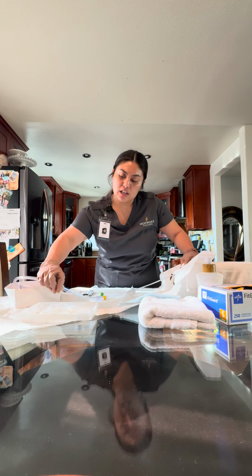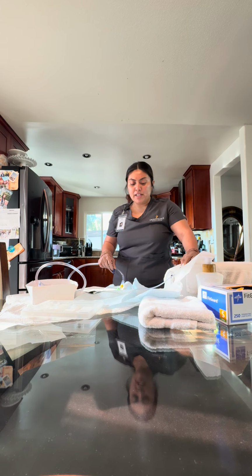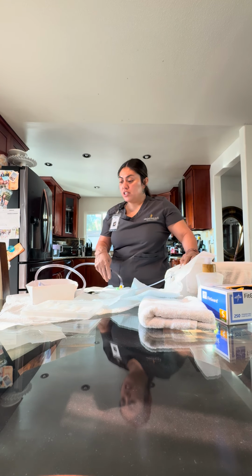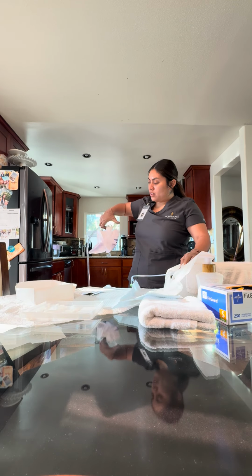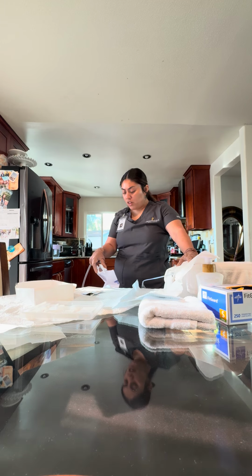I'm going to secure the Foley to my patient below the bifurcation to make sure the Foley does not become removed. After securing it to my patient, I'm going to grab my Foley catheter bag. Now that the urine is going inside my Foley catheter, I'm going to assess it. I'm going to check for output, for any cloudiness, and for consistency and color.